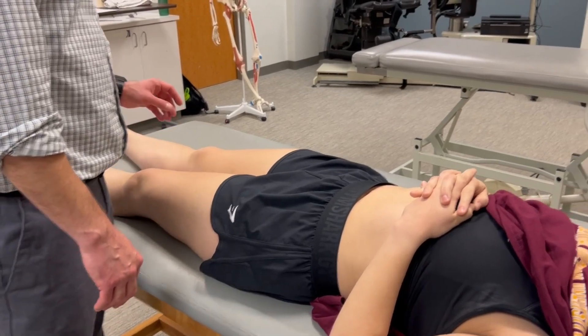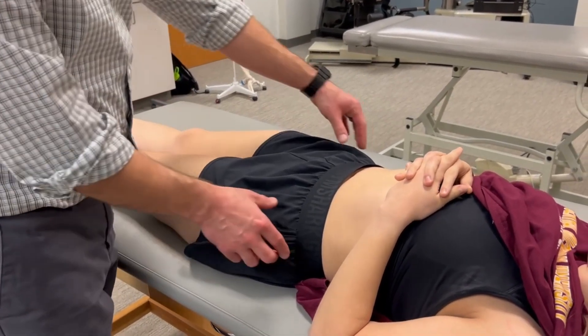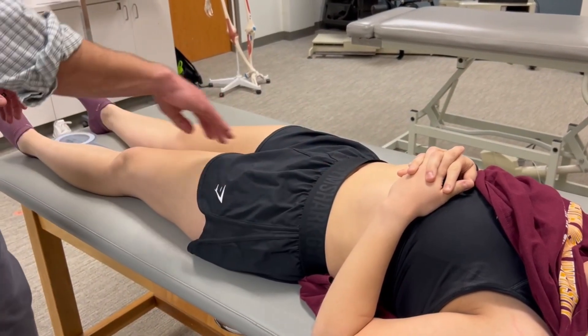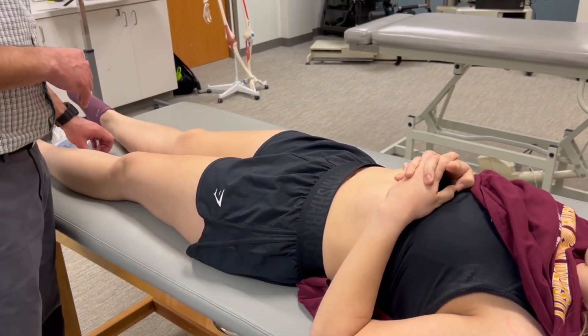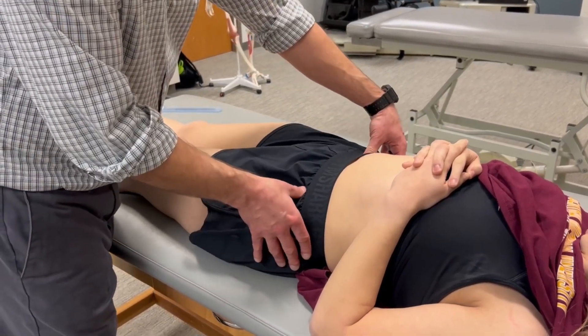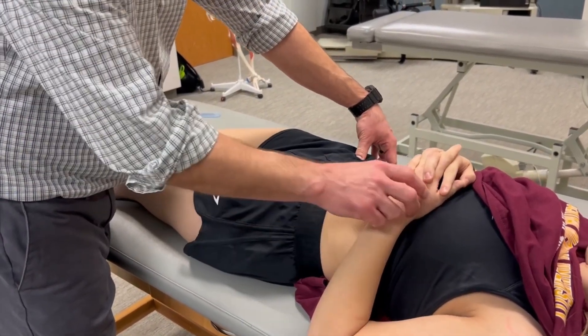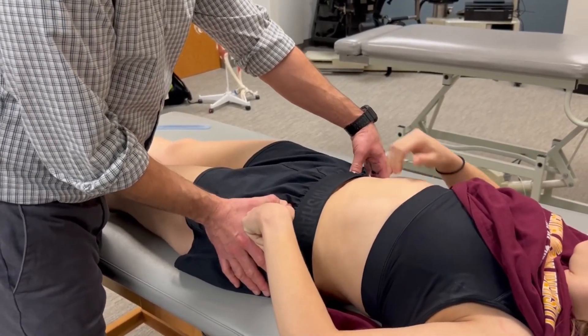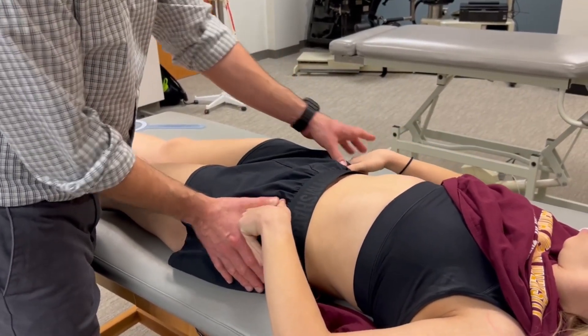For adduction passive range of motion, the zero position is the line connecting the ASIS, perpendicular to the anterior midline of the thigh or femur — just like abduction. If we find the ASIS, we can have the patient help by placing their thumb right there and then right there, so the patient can help us identify that imaginary line connecting the ASIS.